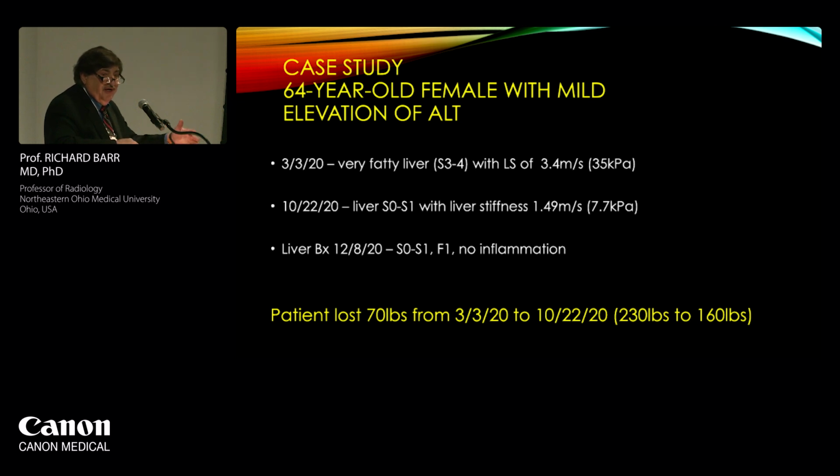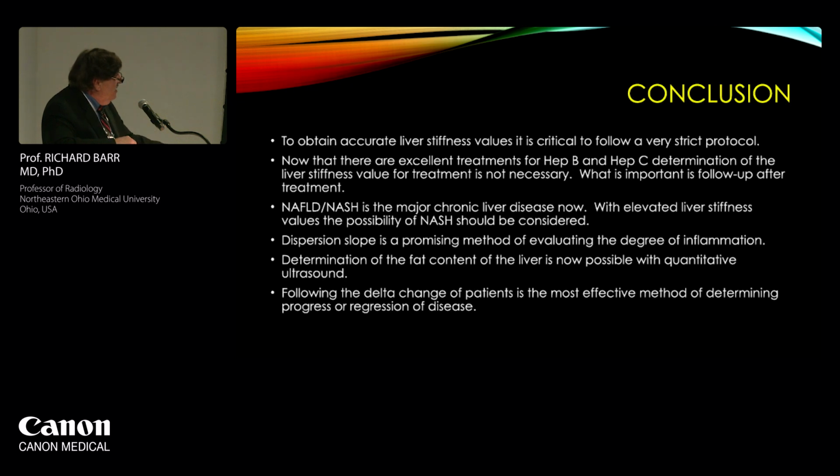So again, I think we need some more research, but doing ultrasound and looking at the change over time and how these people react to treatment may be an easy way to get away from doing liver biopsies and still make a diagnosis. We didn't have time to go over the strict protocol. It's very, very strict, and you have to follow everything. I recommend you look at the SRU guidelines from 2020.